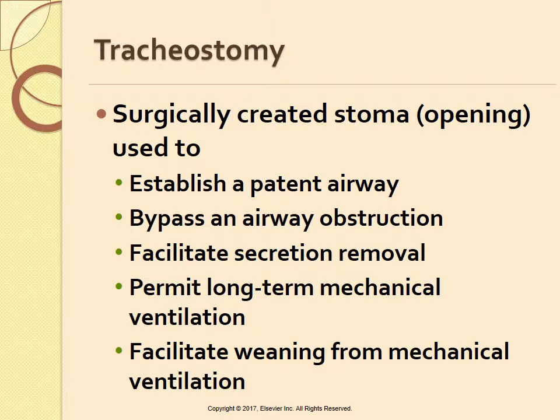A tracheostomy may be undertaken to, number 1, establish a patent airway, number 2, bypass an upper airway obstruction, number 3, facilitate removal of secretions, number 4, permit long-term mechanical ventilation, or number 5, facilitate weaning from mechanical ventilation.